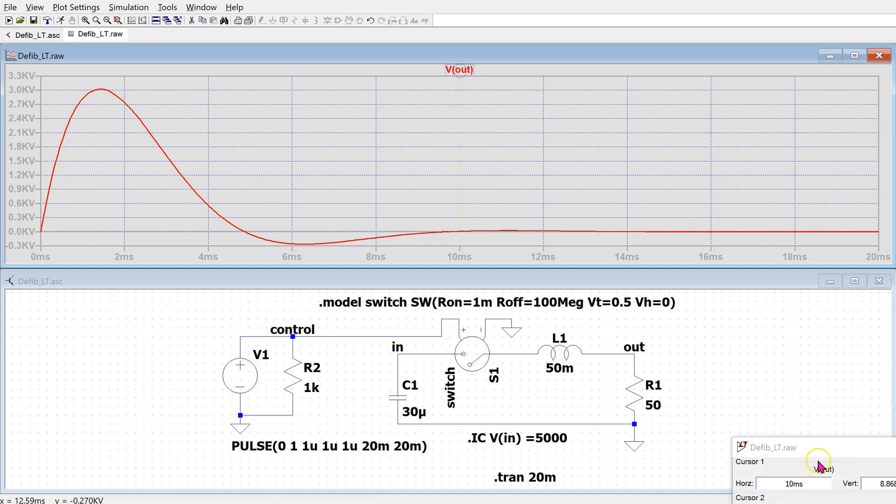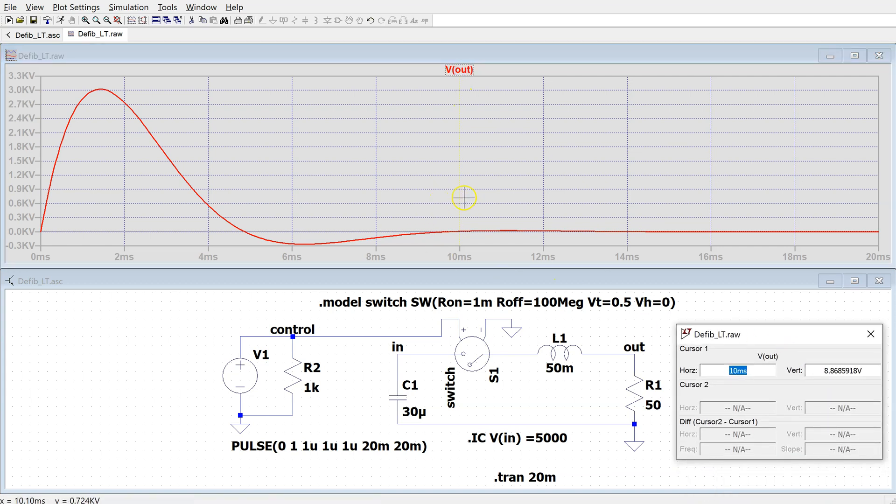We can click here to enable the cursor and then we can move the cursor to see that the peak value of the output voltage is around 3000 volts. The output voltage lasts a few milliseconds and then quickly dies to zero.